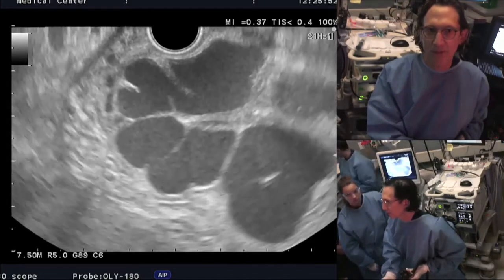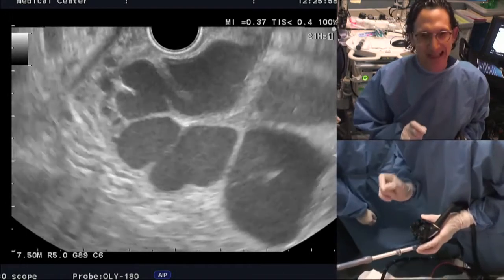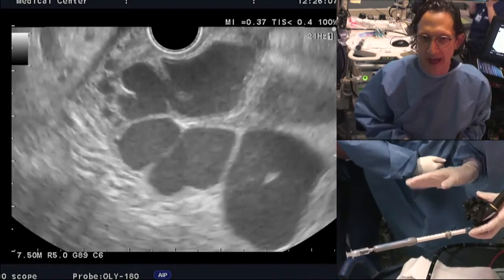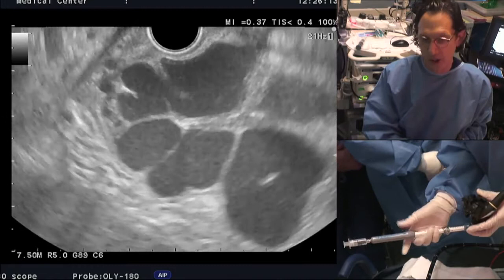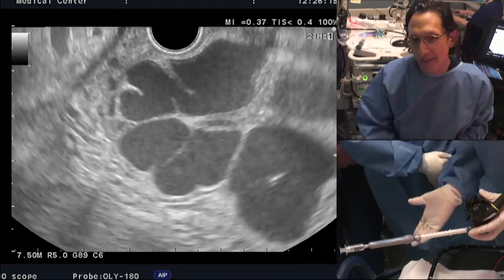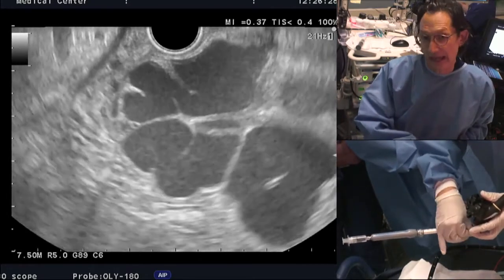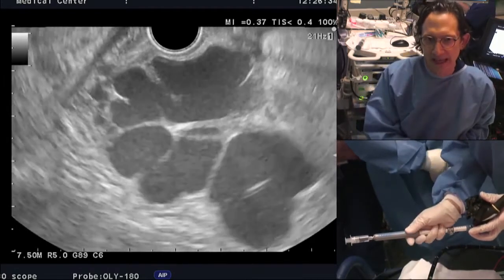This is just like what you saw before with the Axios. Now, one thing I can tell you about a 19 gauge is with a plastic sheath, unlike a coil sheath, a plastic sheath will stick against the elevator. It won't negotiate the elevator at times. And if you encounter resistance advancing your needle, do not force it, because you will puncture your working channel. So you got to go back and advance your sheath forward. In fact, it's probably a good practice to always advance your sheath first. But it's actually not necessary when you use a coil sheath, and that's why I like coil sheaths. But this doesn't come with a coil sheath, only a plastic sheath. All right, so now I'm going to advance this.